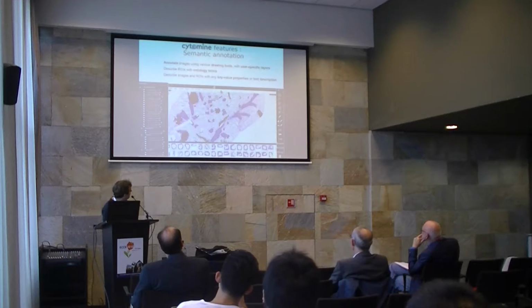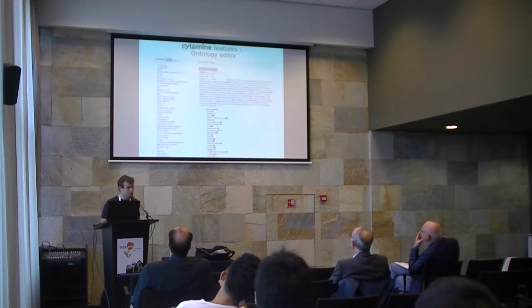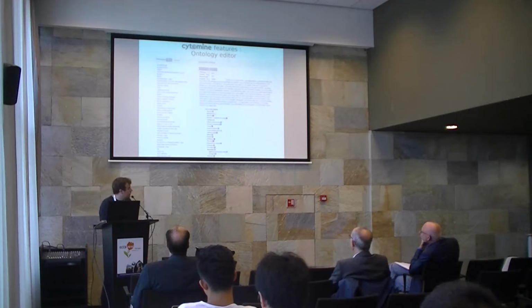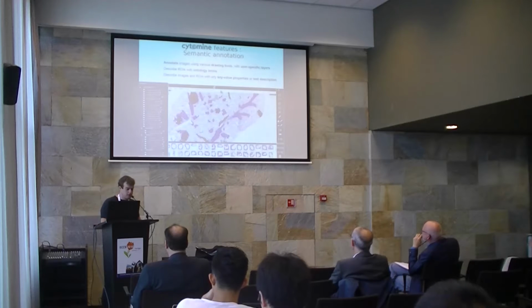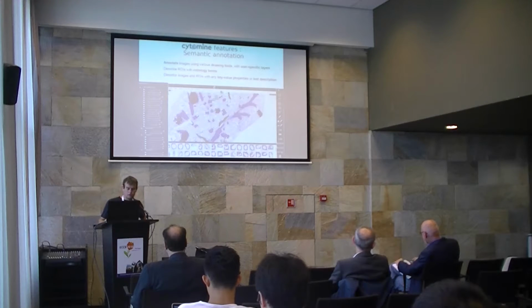One of the information is the ontology terms. So it's possible to define directly on the web interface an ontology. So this is basically a vocabulary of terms that each of the pathologists can define for his project. And so it's a list of objects that they can visualize in their images. And so at the end, the colors correspond to the different terms from the ontology.